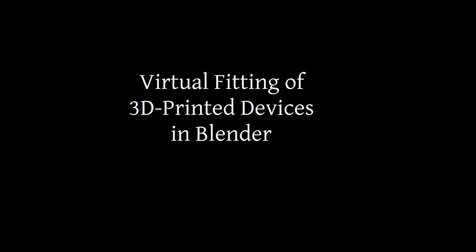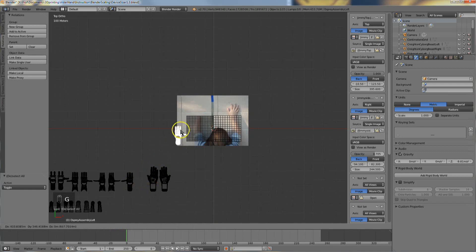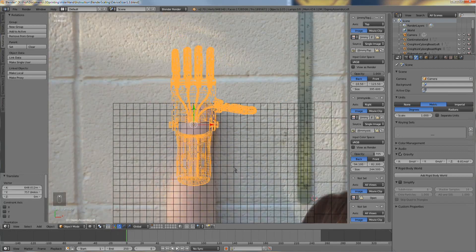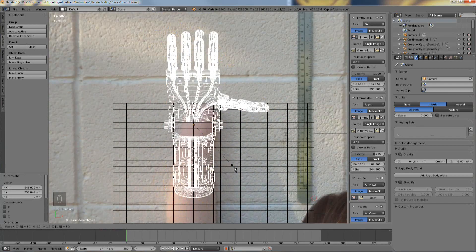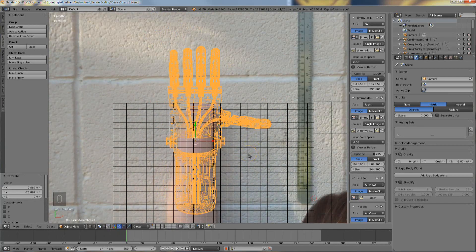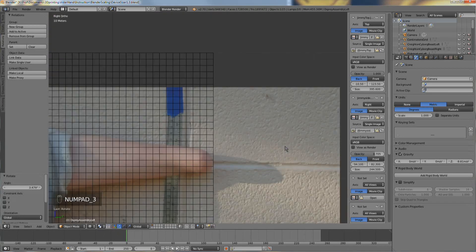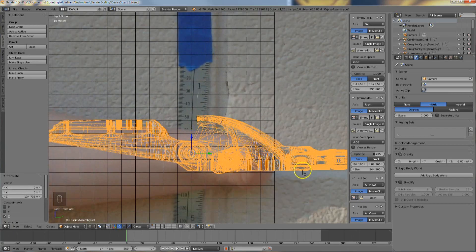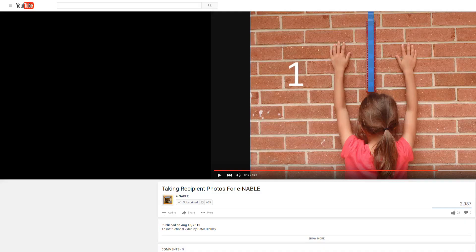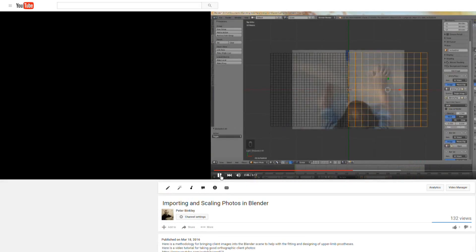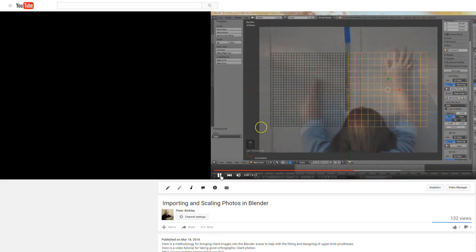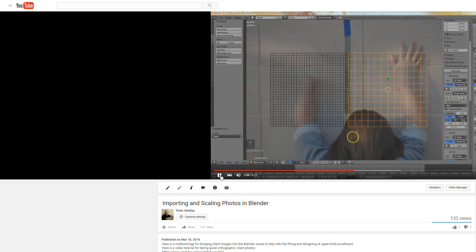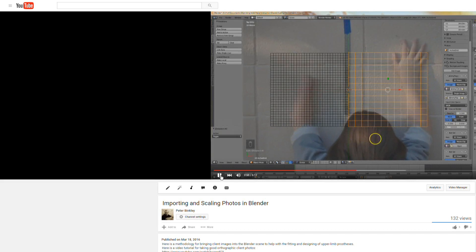In this tutorial, we're going to use Blender to determine the proper scale to print an Enable hand for a client. If you haven't already watched taking recipient photos for Enable and importing and scaling photos in Blender, please go back and follow those tutorials first. Please see the video description for links to those videos.